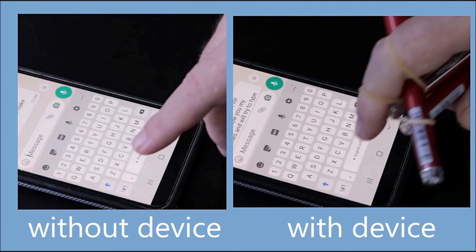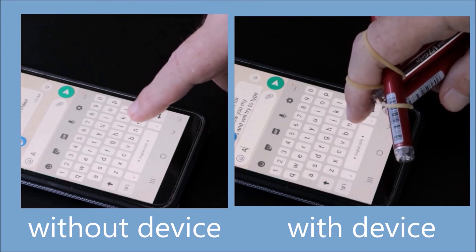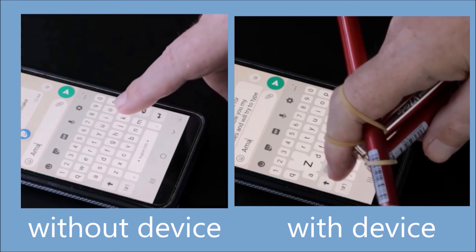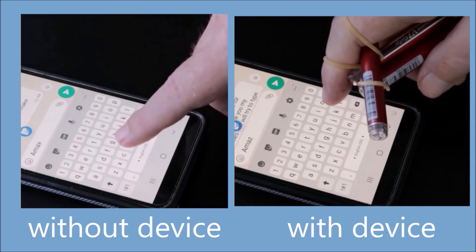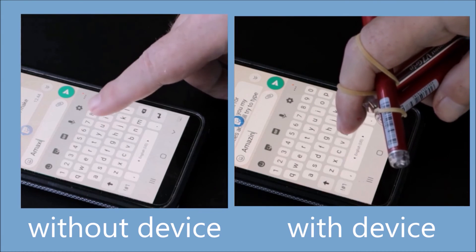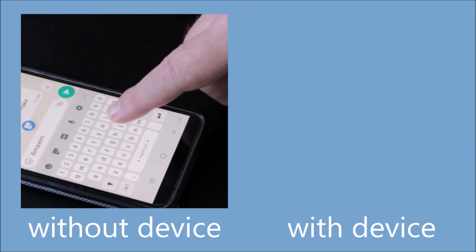Let's take another look at my typing with and without my device on two different screens. Look at the left screen — my finger makes oscillatory movements on the keyboard and, due to fatigue, makes many typing errors, so it's very difficult to write. My device on the right screen limits the oscillation and I type faster, more confidently, and do not make mistakes.